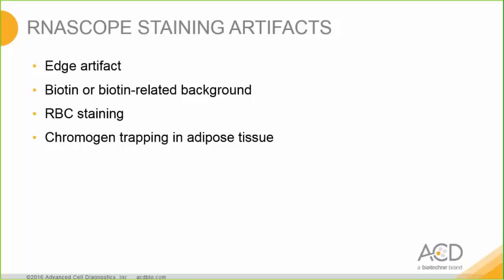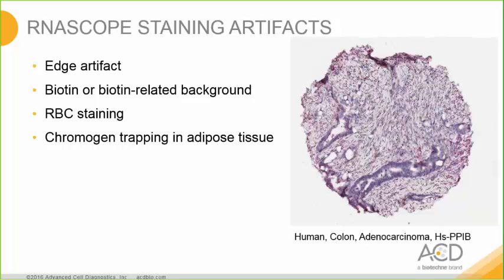While RNAscope is a powerful tool, there are occasions when you may be faced with some artifactual staining that you may wonder about how to deal with and/or what it means. As with IHC, there may be an edge artifact where there may be more signal at the edge of the tissue. Slightly seen here, the edges of this core tissue. Focus should be placed on scoring tissue slightly away from the edge if this edge artifact is seen.